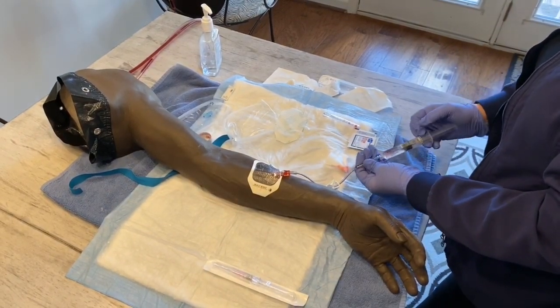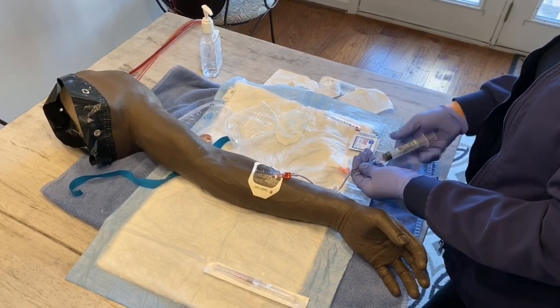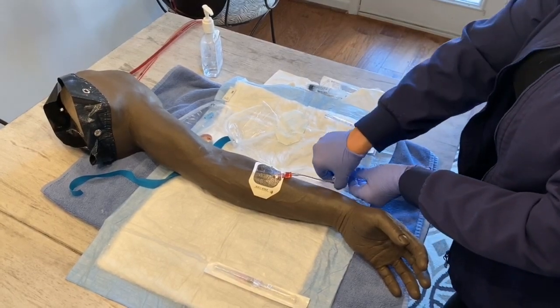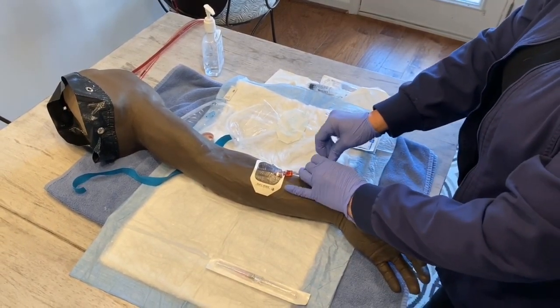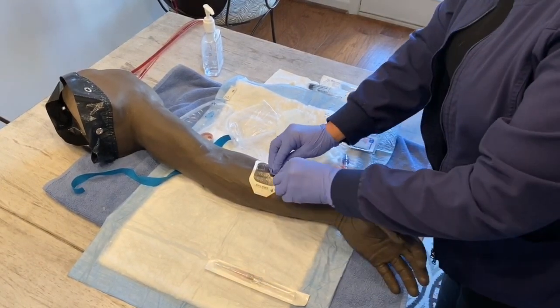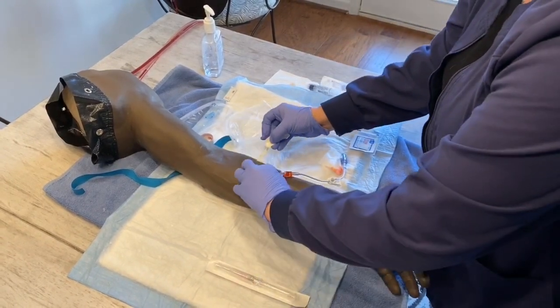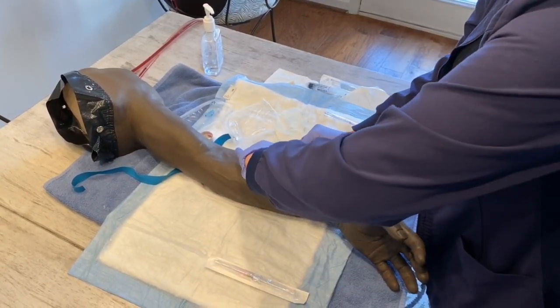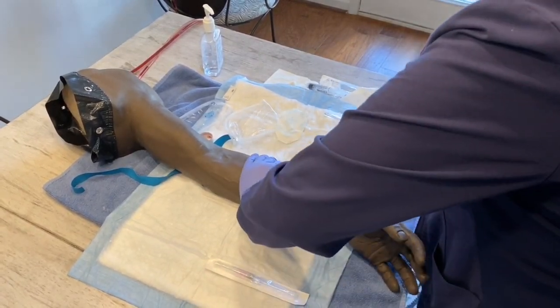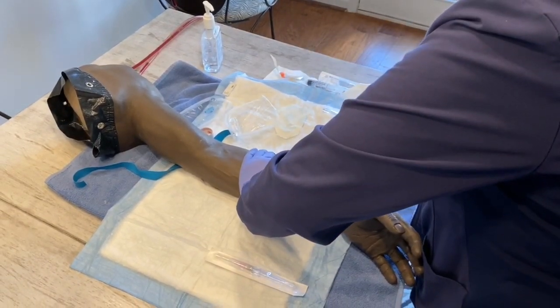I'm going to go ahead and flush the rest of the saline flush in. I'm going to detach and get rid of, and I'm going to go ahead and clamp the site. Okay. Now, this Tegaderm, you want to peel around, making sure that it stays to the skin. And just so you know, if the Tegaderm does not want to stick, if you lay your hand, the heat from your body will help it to stick to the patient's skin.